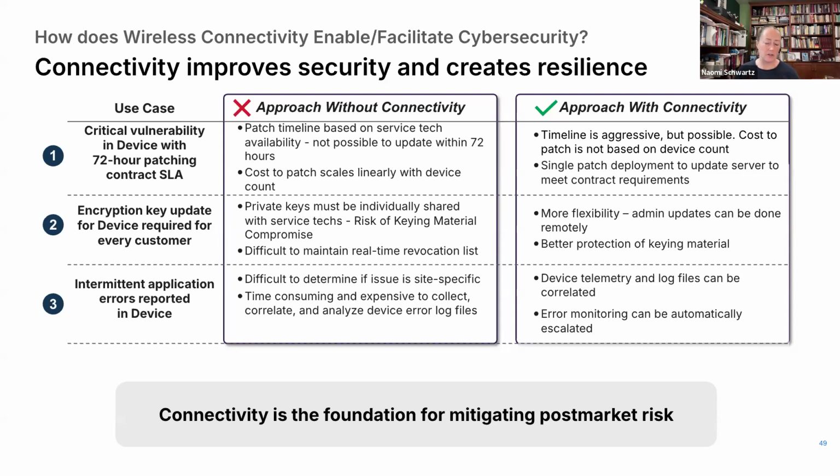You have more flexibility. You can do administrative updates remotely. You have better protection of your keying material. You have device telemetry and log files that can be correlated. You can pull them back more rapidly and make decisions about whether or not you're seeing a cybersecurity signal. So connectivity is really the foundation for mitigating that post-market risk.